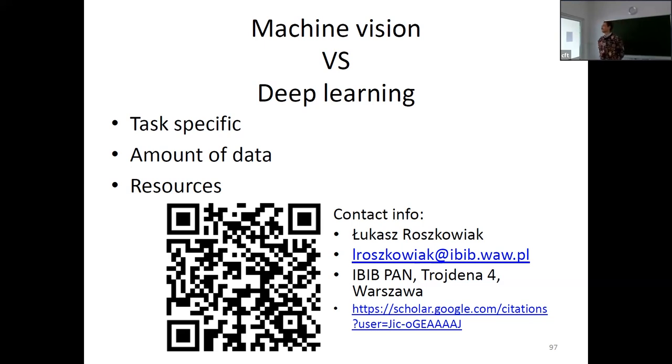Thank you for those questions. Yes, the first one: as you can see in the slides, sometimes the annotations are quite rough. And when you have those annotations, you could use some fuzzy methods to change them and change the boundaries of the annotations and provide that to the network. And the slight changes can actually improve the results.